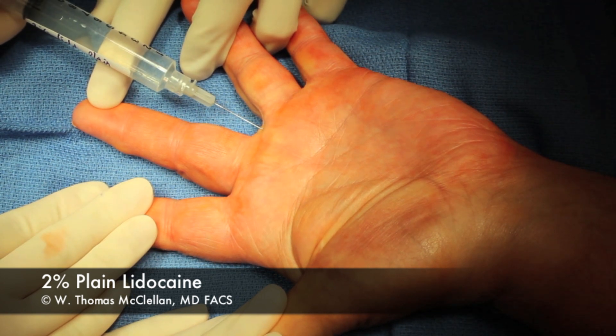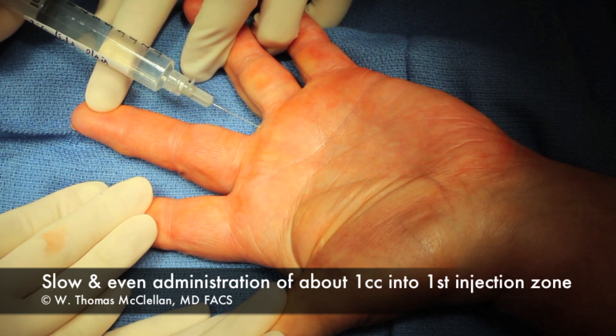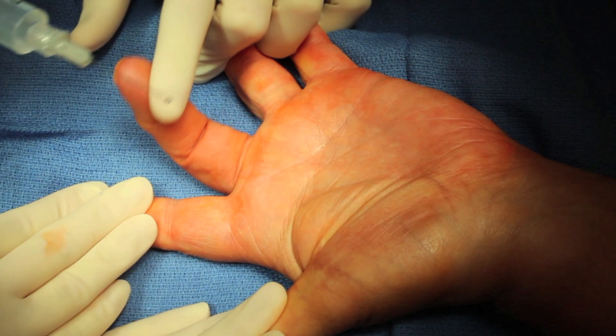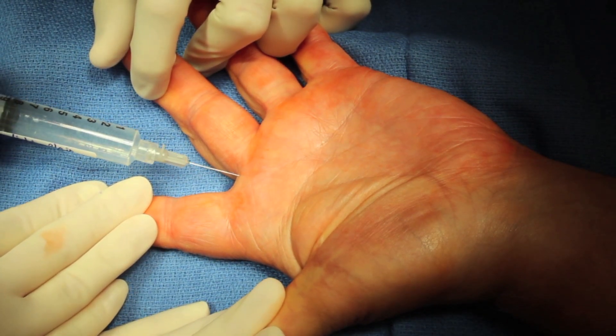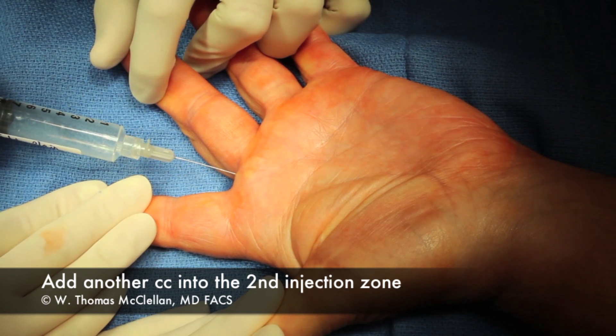I don't put the needle in very far — just under the skin — and I inject very slowly and evenly in this area. Generally I put about a CC in. Then I'll go over to the other web space of the finger that I'm working on and I'll inject slowly into that injection zone, not going very deep.